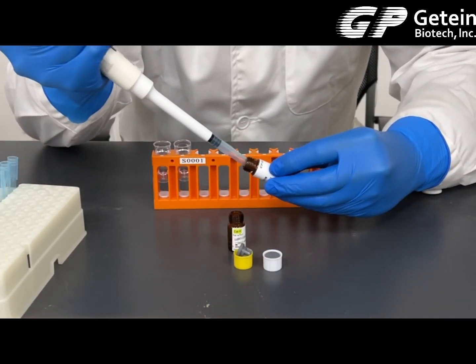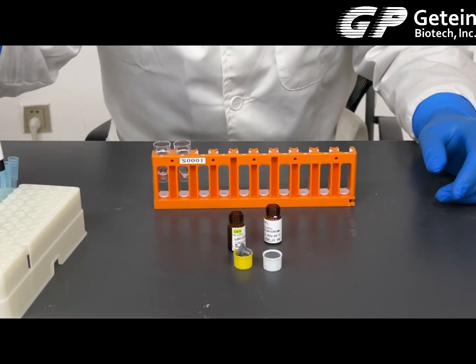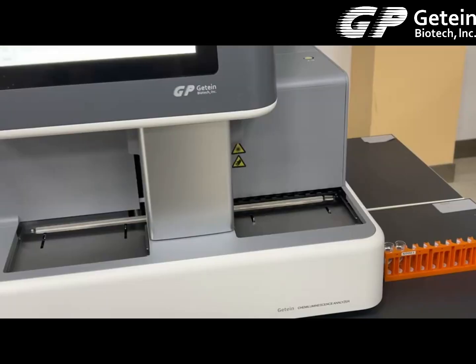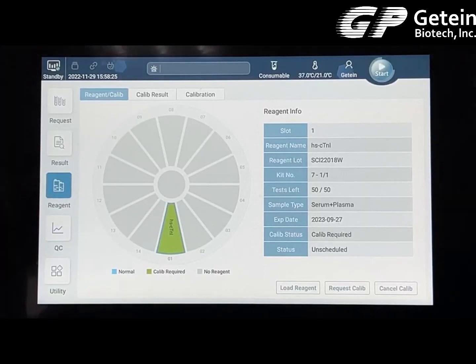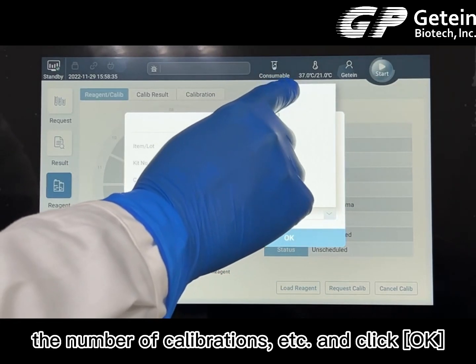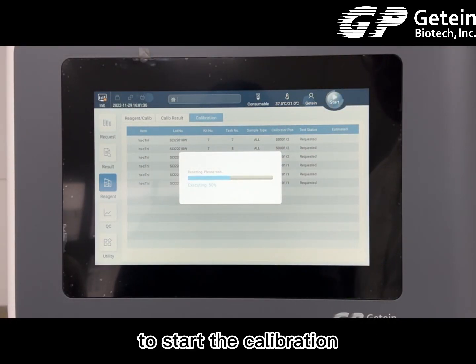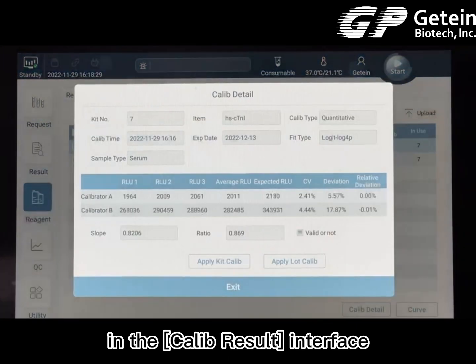Open the calibrator and add it to the Hitachi cup. Place the Hitachi cup on the calibration rack and then place it in the sampling area of the machine. In the reagent interface, click on the request calib button. The pop-up screen allows you to select the sample type, the number of calibrations, etc., and click OK. Click on the calibration bar at the top to see the calibration task and click Start in the top right corner to begin. After the calibration process is done, you can check the calibration result in the Calib Result interface.